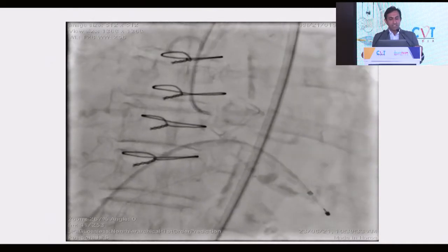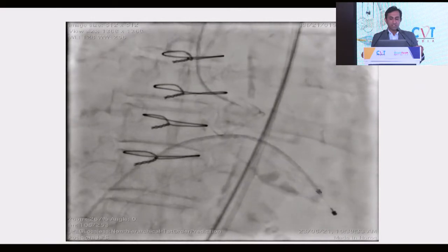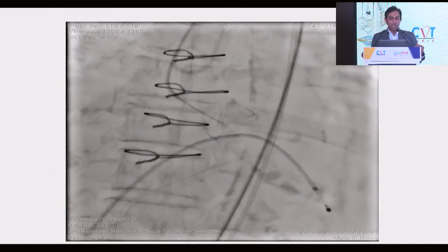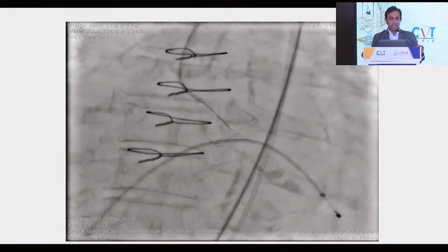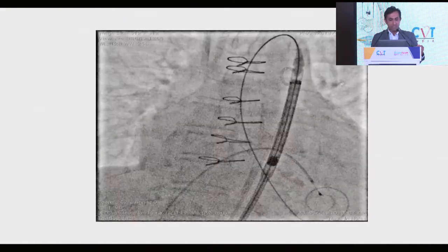This is a coronary angiogram just to show the relationship of the coronary artery to the valve. And again, the crossing was a challenge in this patient. You can see this is a JR catheter, which I have used to cross. This is maybe one or two times where I had to use a JR catheter to cross a valve, and that's because the opening becomes very eccentric in a failed bioprosthetic valve.